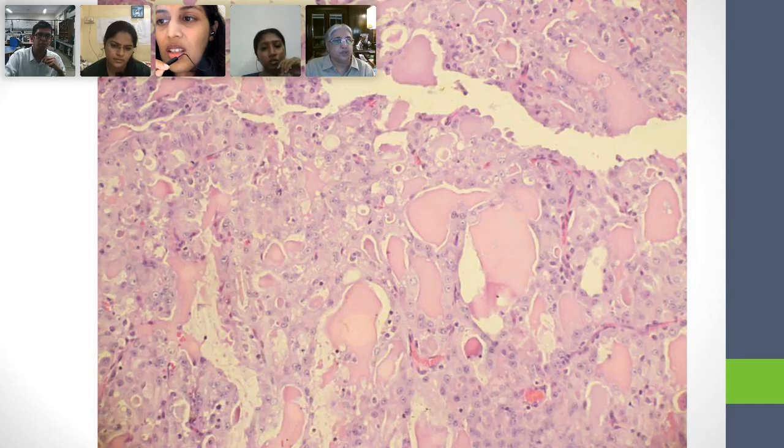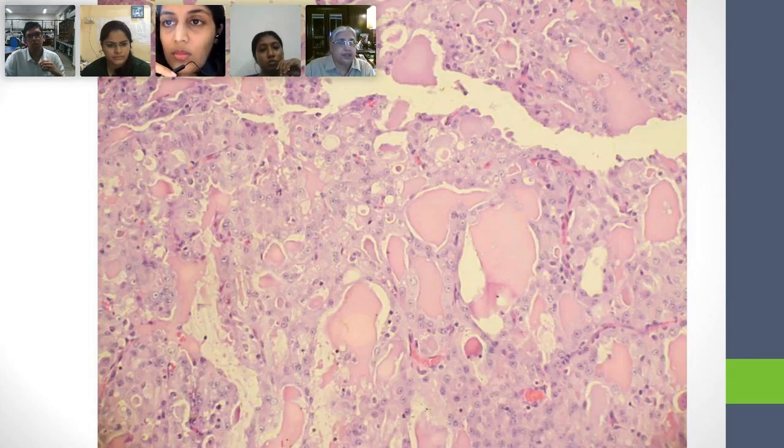Inside the lumen. Can you see lumina or not? You see small and large, but most of the lumina, and there are many, are small. So small that you can't actually see them in many instances, except where these colloid-like structures are present inside the lumina.